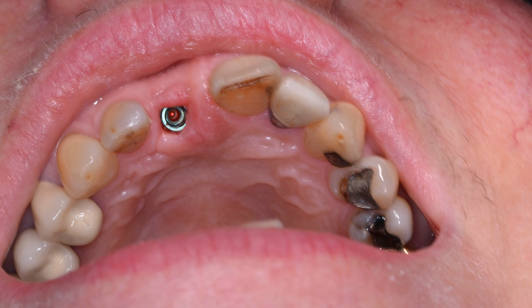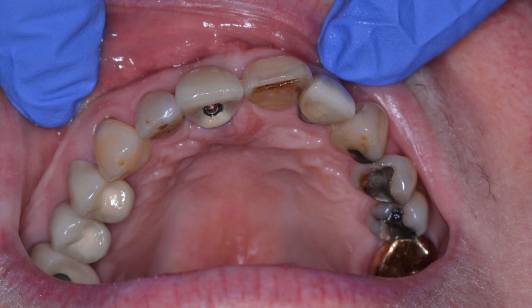So the first thing we do is we clean that up a bit, and we're going to have to clean up a little bit of the soft tissue. You can see the remnants of that H incision, see how it really sort of helps bulk up that connective tissue in and around the implant. We try the implant in as per the previous lecture. You basically want to make sure that there's passive contacts. You want to make sure that the implant is seated by taking a radiograph, and you want to check the occlusion for the patient. So in the end result, this is what you can see. Beautiful.